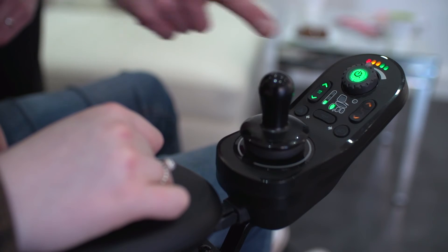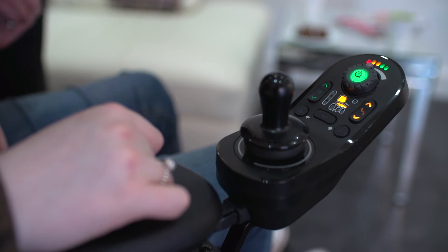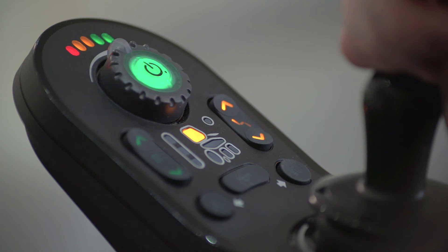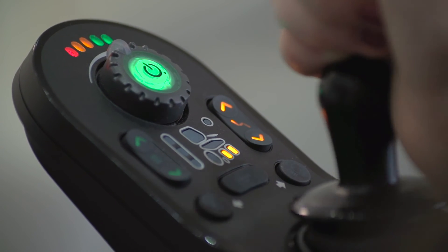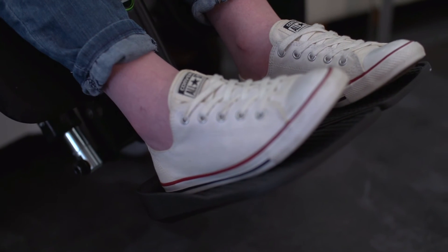The seat buttons can be accessed via the simple seat button. Seat functions can be programmed to be displayed in a set pattern or last used method, whichever is preferred. Simply press the seat function button and then left or right joystick movements selects the seat function, whilst the forward-backwards joystick movement extends or retracts that particular function.